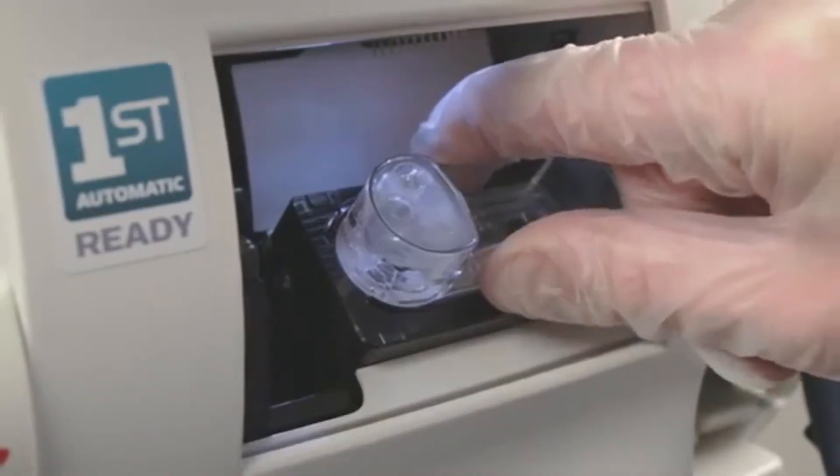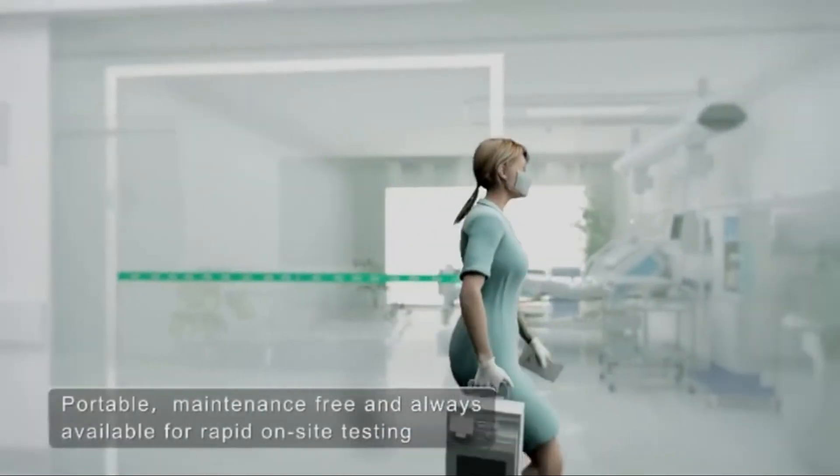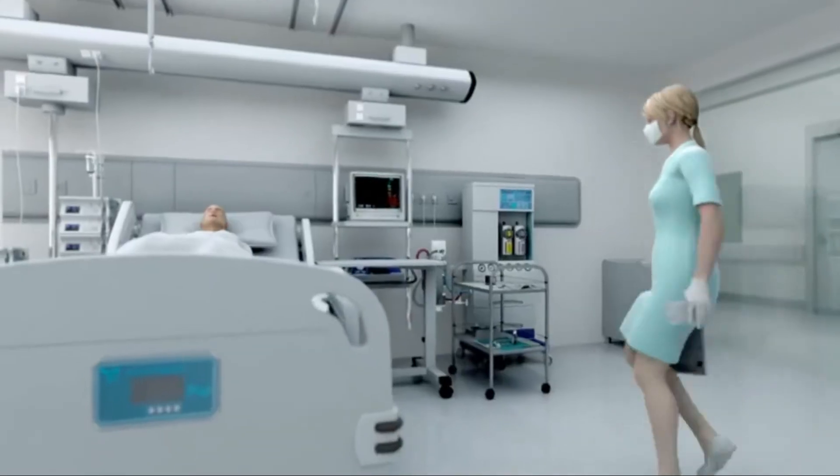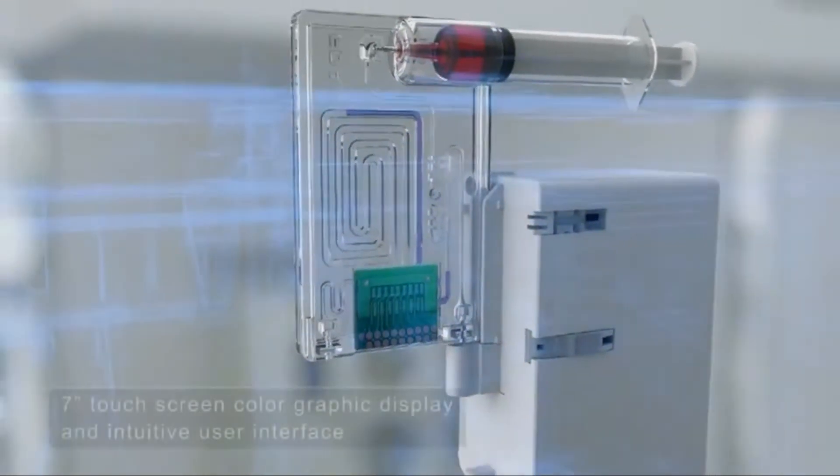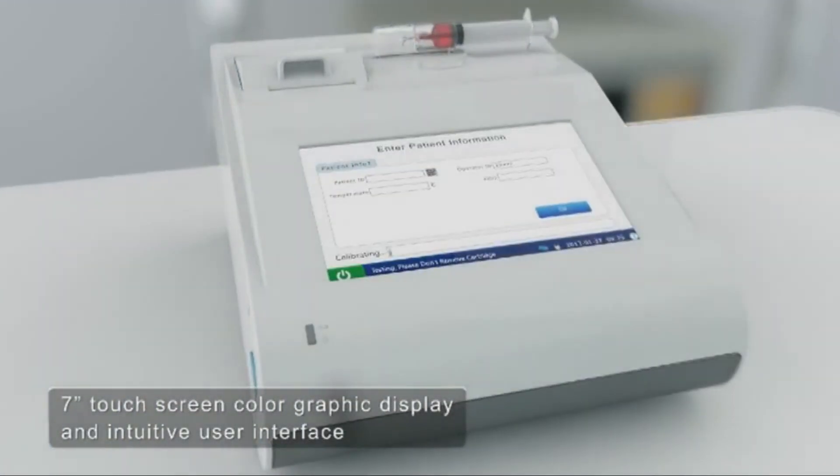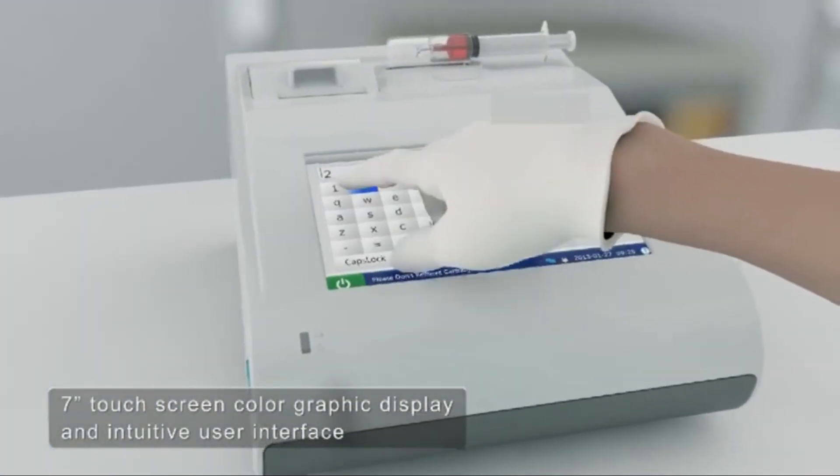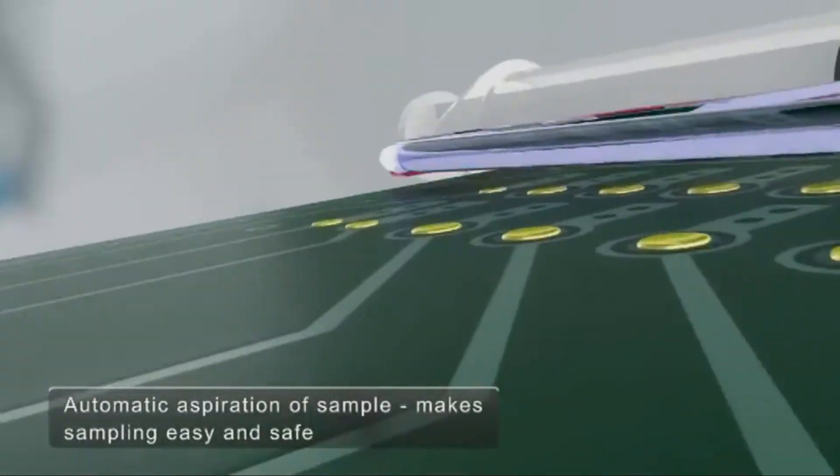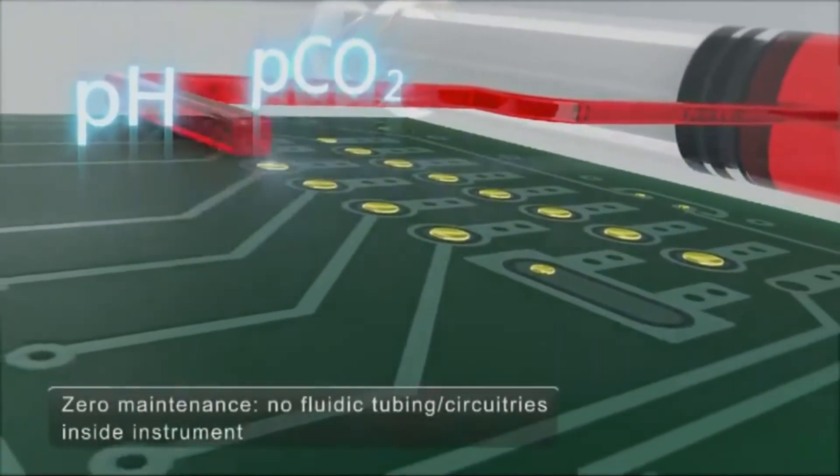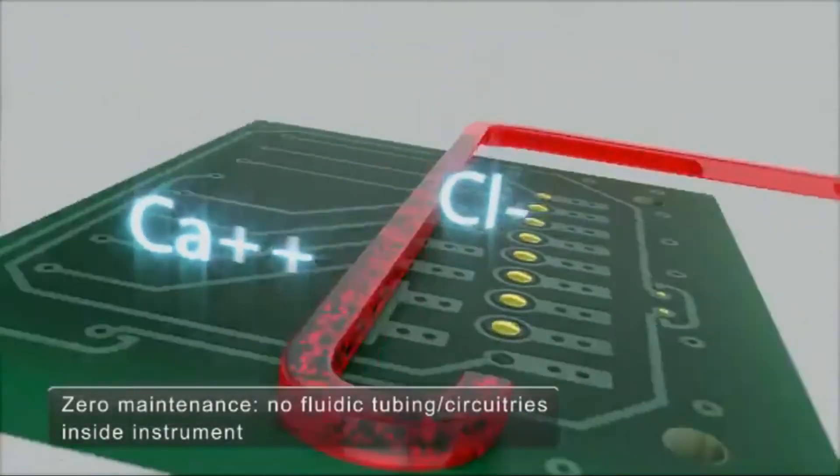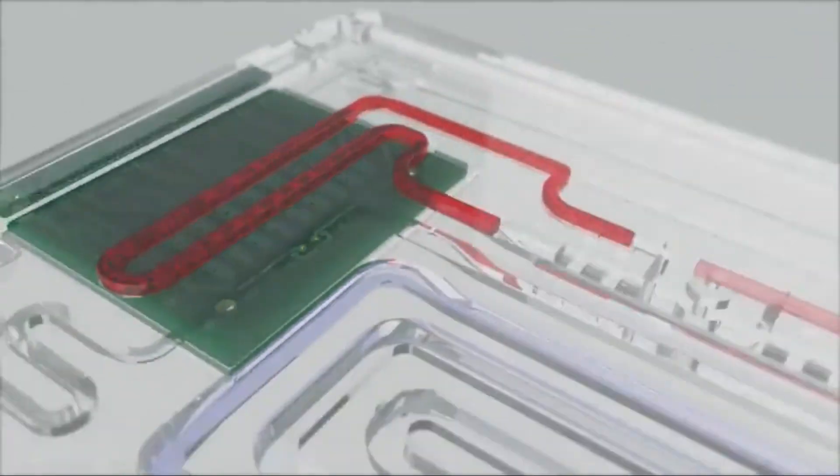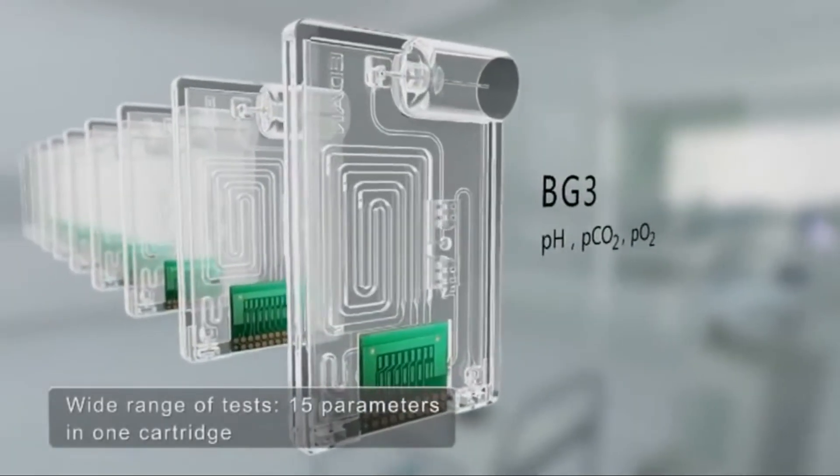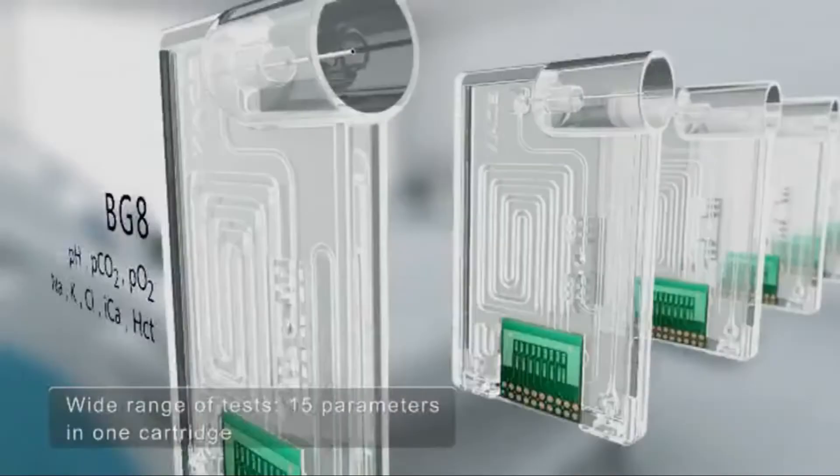The second is a portable or handheld ABG analyzer. This type of ABG analyzer consists of simple cassettes which contain different electrodes or sensors which determine the ABG values directly interacting with the device. This type of device doesn't need any reagents or supplies. Only disposable cassettes are used to determine the ABG values for each patient. This type of machine is very helpful for intra-hospital transport in different departments of the hospital.